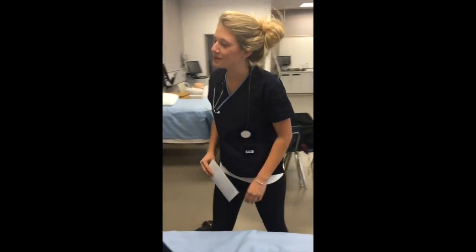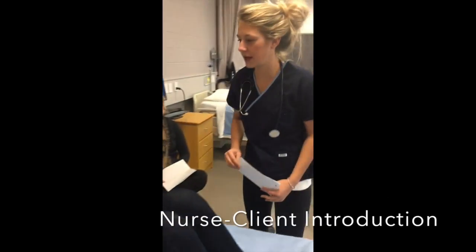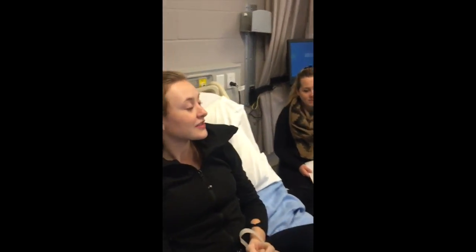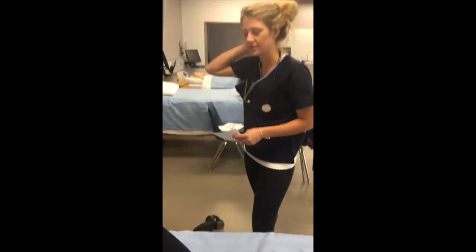Good morning, Kelsey. I'm Jess. I'm a student nurse at Georgian. I'm going to be administering your blood transfusion this morning. Okay. Can you just tell me your name and date of birth? Kelsey Walter, September 8th, 2001. Okay, and I'm just going to compare it to your identity bracelet here. Okay, perfect.